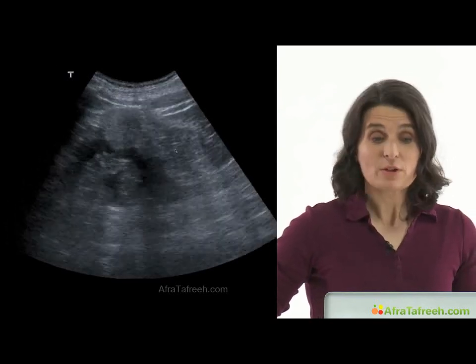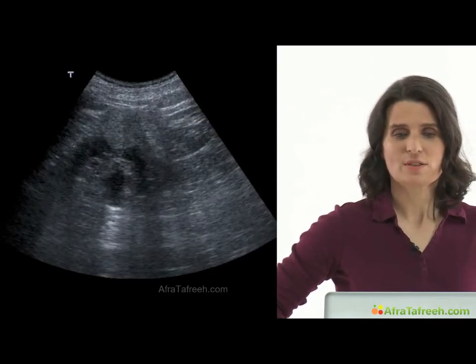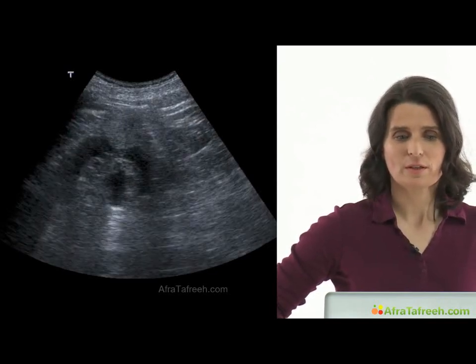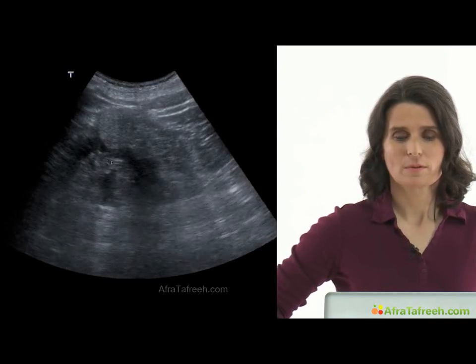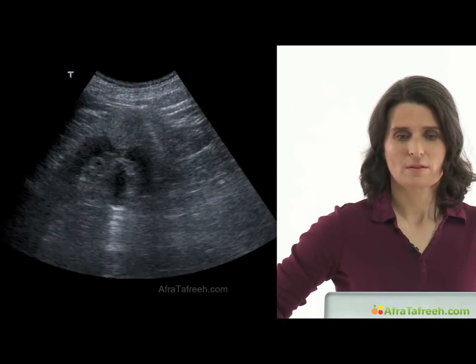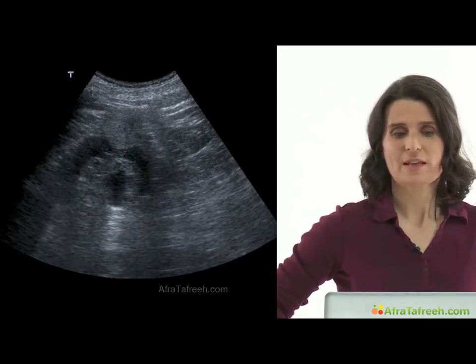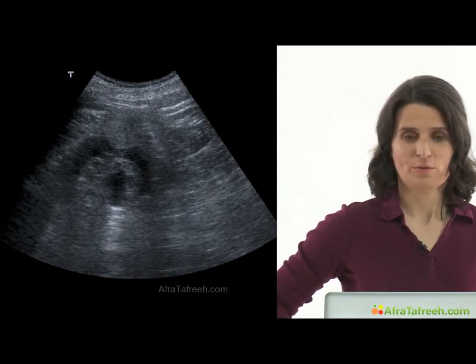Here, a video clip of the same lesion. It's easier to distinguish now. The kidney over here. A little bit dilated renal pelvis. And this protruding round tumor, in this case hyperechoic, but it's really exceeding the border of the kidney.